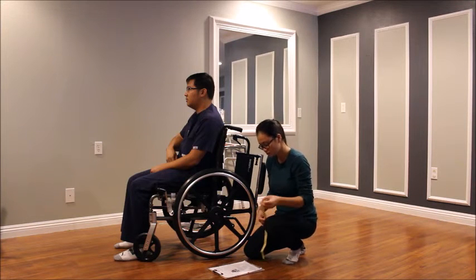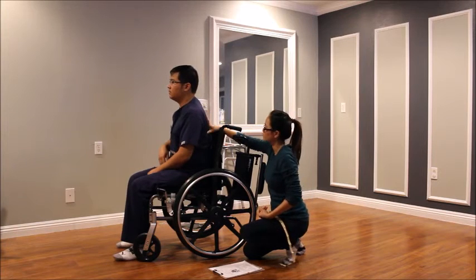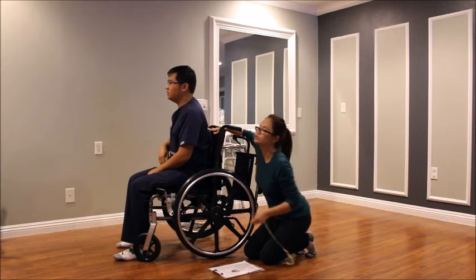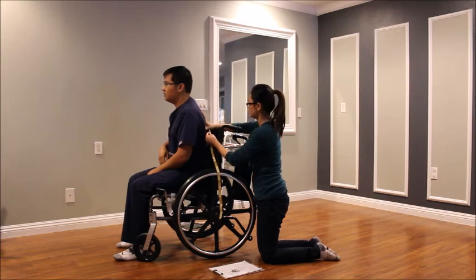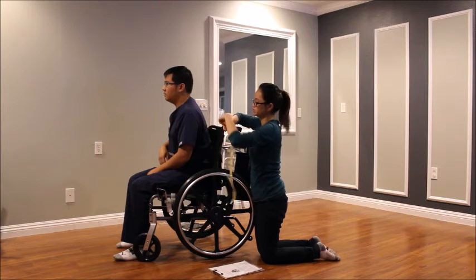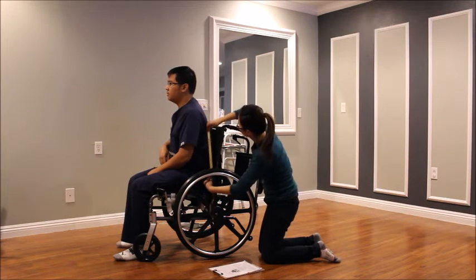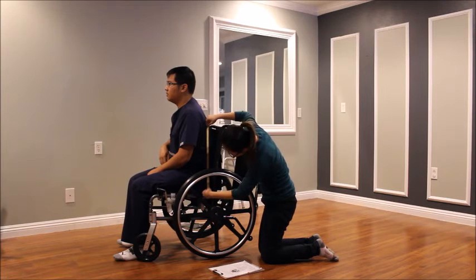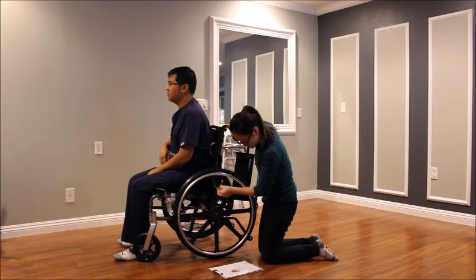So what we do is we measure for the mid-back of the scapula. Right here, usually it's about 1 or 2 inches down to the scapula. So from there, okay, find the scapula. From there, you measure down to the buttocks region. And that's about 17 inches.